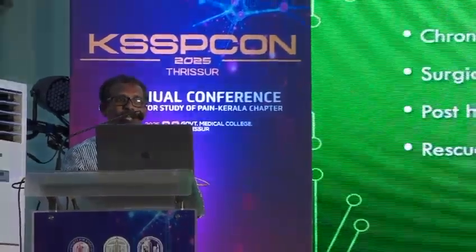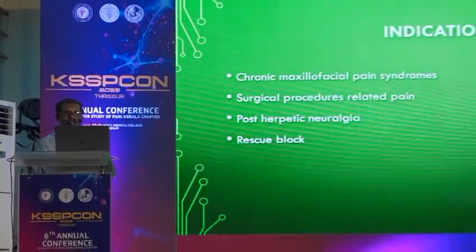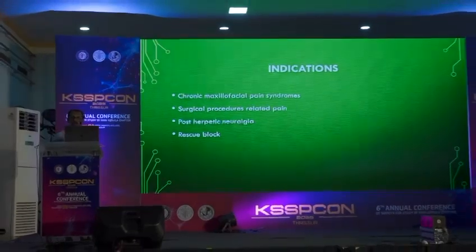The indications are chronic maxillofacial pain syndrome, surgery-related post-operative pain, post-herpetic neuralgia, and sometimes rescue blocks when your Gasserian ganglion block fails. And these are only terminal branch blocks. We are not actually targeting the foramen ovale at all.